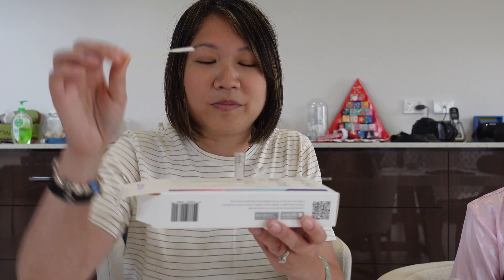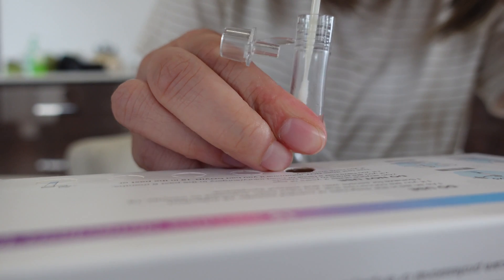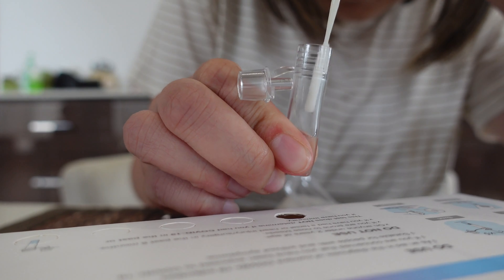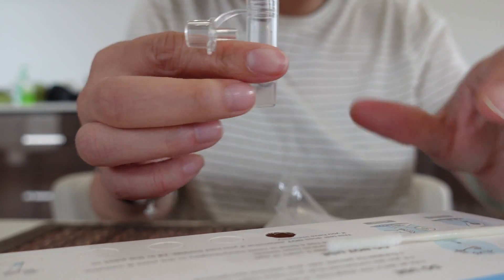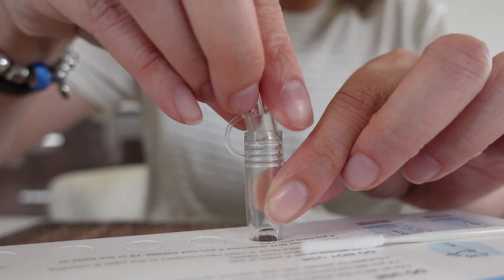Now take the swab and put it inside the tube. Squeeze the liquid as much as you can and pull the swab out. Place the cap to tighten the tube like this.